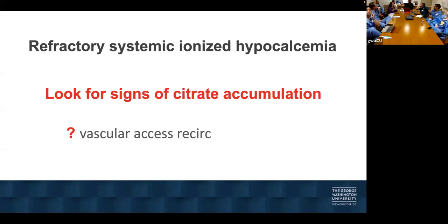You don't want it to mix. This is the calcium you're returning. You've already chelated all the calcium. Yes, so that might be a risk for recirc as well, if you do so.